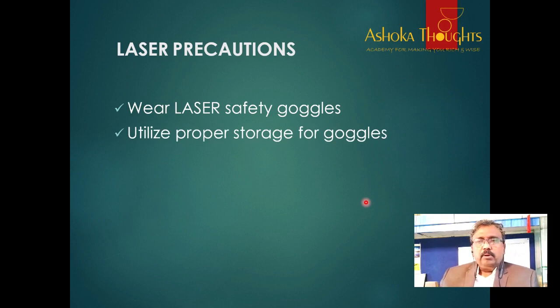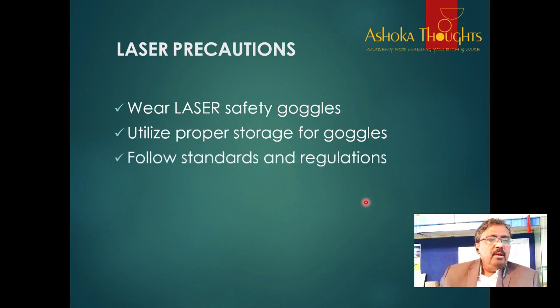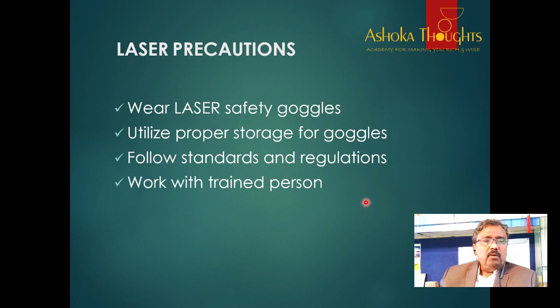Utilize proper storage for goggles. The goggles must be protected from scratches because they are expensive, and if there are scratches, naturally the goggles will be useless. That's why utilize proper storage for goggles. Follow standards and regulations of lasers given by the authorities. Always work with a trained person. Use warning signs which we have seen earlier.